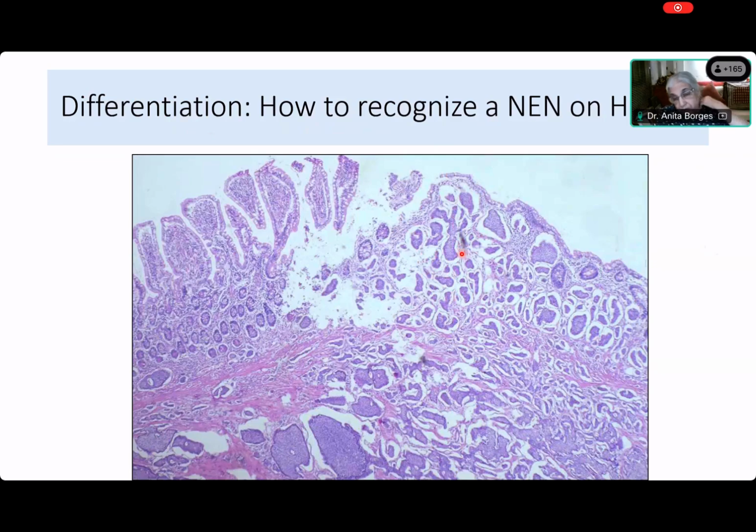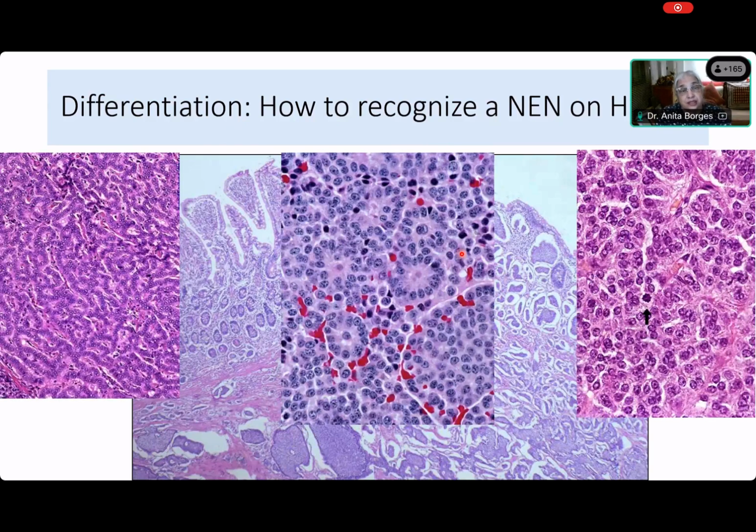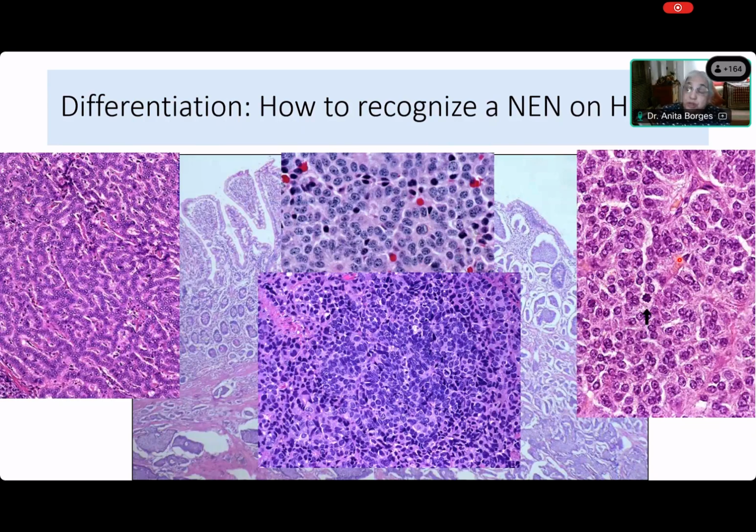Okay, we've seen that before when we saw the pleomorphic adenoma. The pleomorphic adenoma didn't look like any normal salivary gland structure. And here is a neuroendocrine tumor. Okay, and this didn't look like anything. It's looking like cords. Here it is showing you rosettes. Here it is in sheets with a vascular pattern. But I recognize these as being neuroendocrine morphology, just as I recognize this, which we saw before, as a small cell carcinoma, which also has neuroendocrine morphology.